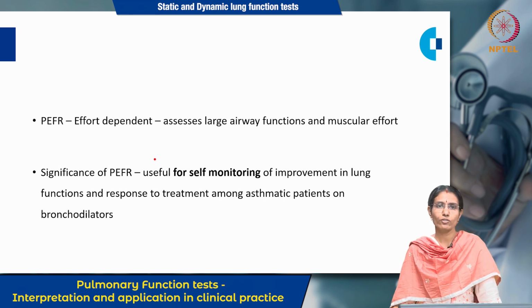What is the significance of this peak expiratory flow rate? The peak expiratory flow rate can be used for self-monitoring by asthmatic patients. When asthmatic patients are started on bronchodilators, for self-assessment they can use this peak expiratory flow rate and assess their own response to therapy. So that is the significance of peak expiratory flow rate.